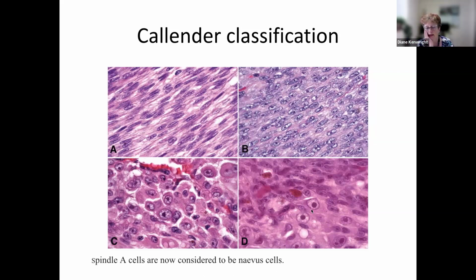Here we can see some epithelioid cells and some spindle B cells. So if you cut a sausage in half, you get a round profile. So how do I know that these little sausages cut in half are not epithelioid cells? Well, it's about the size and the amount of cytoplasm as well. These epithelioid cells, I'm going to use another egg analogy, are like fried eggs with a whole lot of cytoplasm, whereas these spindle B cells, if you cut them in half, have a much smaller cross-section, much less cytoplasm, and all around them you will see cells that look very similar but have ovoid nuclei.